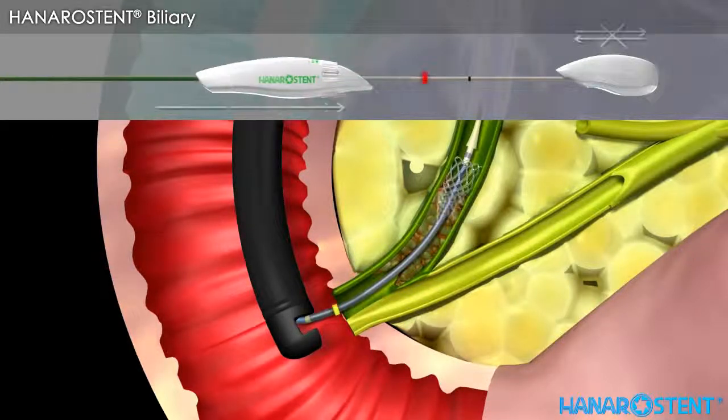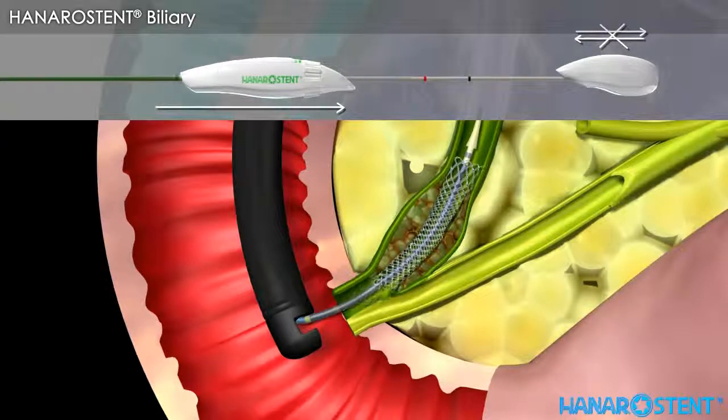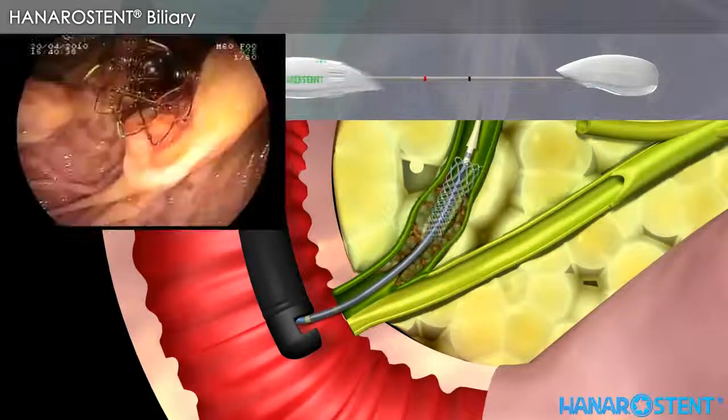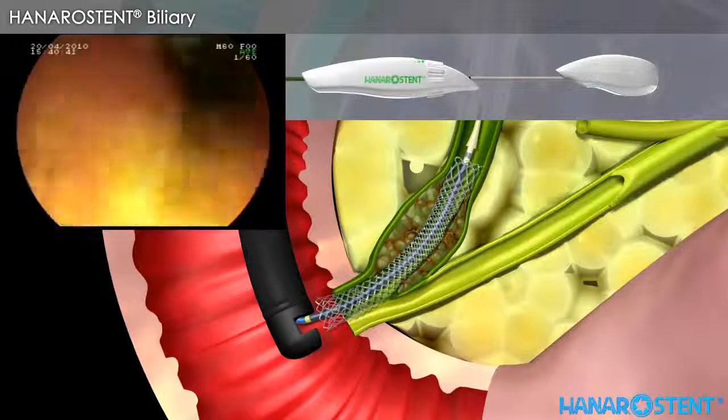Hold the inner shaft handle firmly with one hand and then gently pull the outer sheath handle. Before pulling the outer sheath handle beyond the red marker, the stent is always resheateable by pulling the outer sheath back until it passes the distal black marker. Check the endoscopic view for full deployment and drainage of bile fluid.